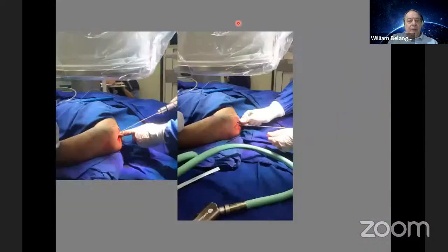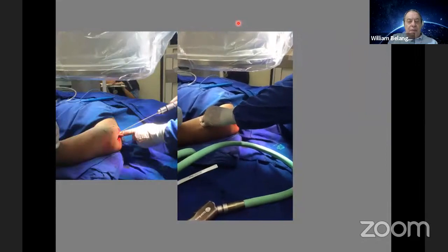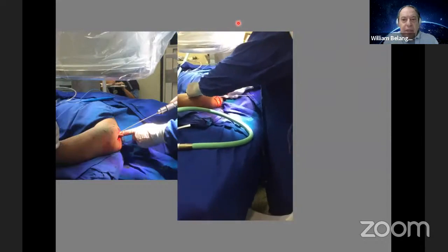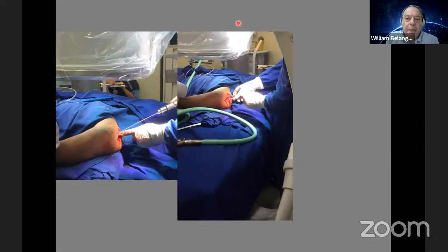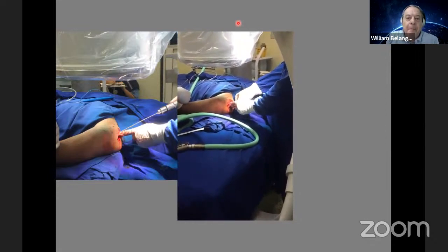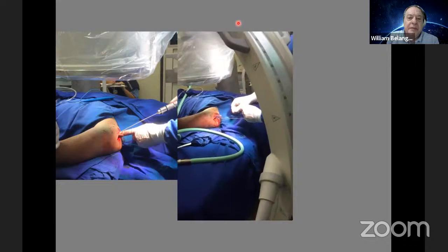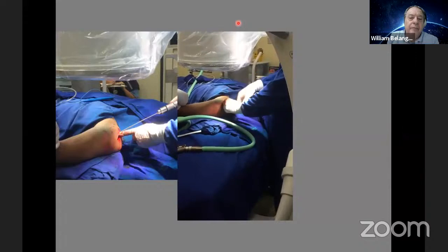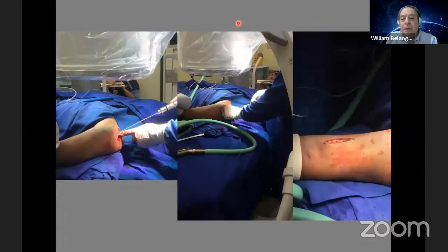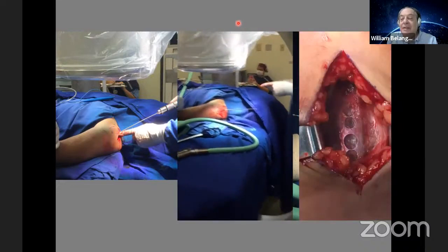You see? Then we introduce the plate from the proximal incision, and the plate goes to the anterior aspect of the humerus. We follow it by imaging in the C-arm. Okay. Then we do the distal approach, and we find the plate inside. You see? We find the plate.